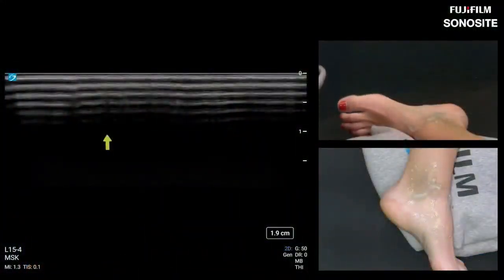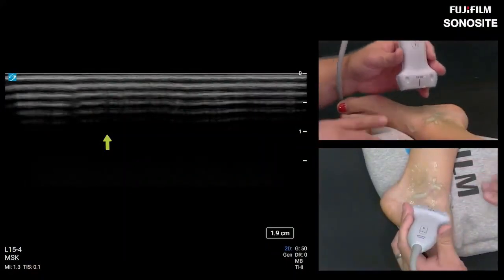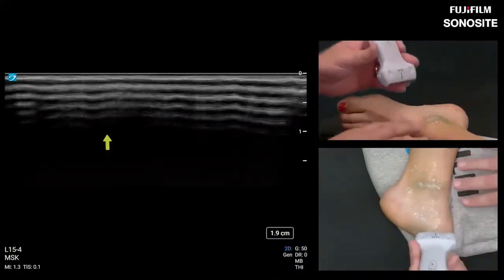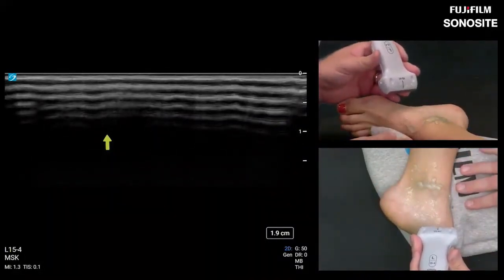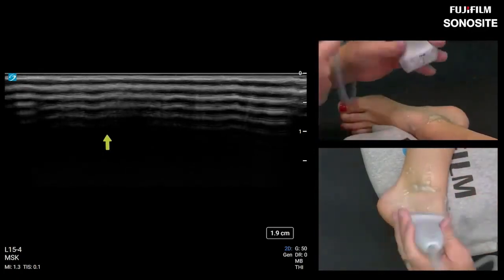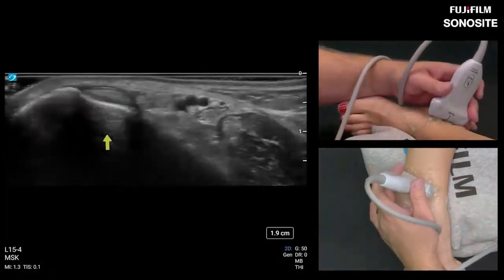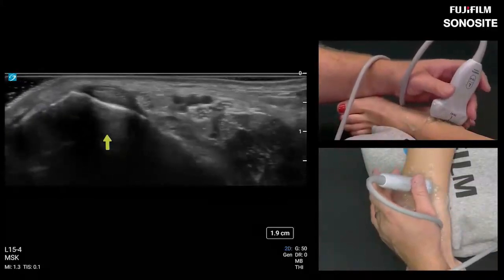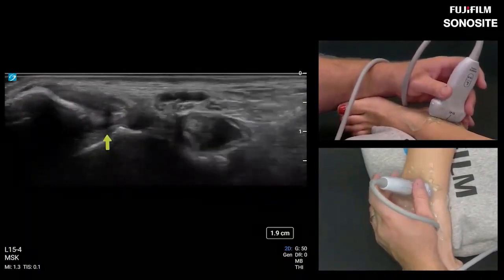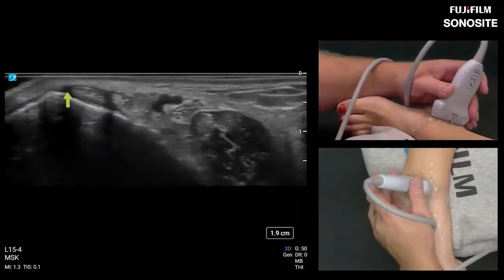Okay, so we're back at the medial ankle. We're going to start scanning for the tendons, which is easier than doing the ligaments. But we're working our way from the deep cortical structures, as in most of musculoskeletal ultrasound, and we're going to work our way more superficially. So I'm going to start on that medial malleolus. Again, screen left is towards the medial malleolus. Very easy landmark to see, and this is definitely something that is easier to see on the 19 megahertz transducer as well. But let's point out the anatomy in this wide field of view that we have. So here's the tibialis posterior, this oval. It's the larger oval.